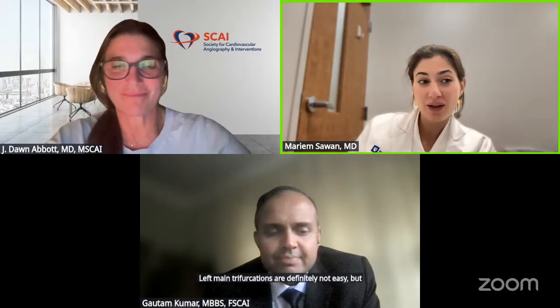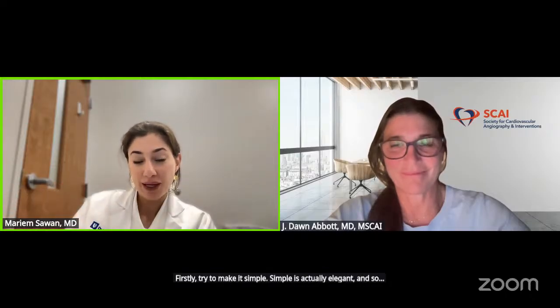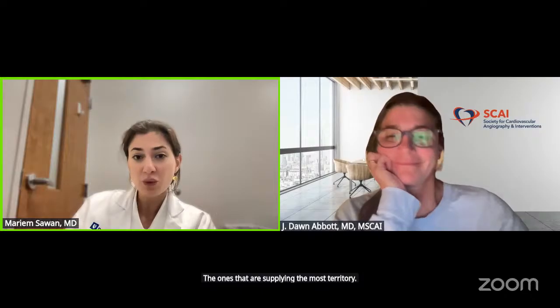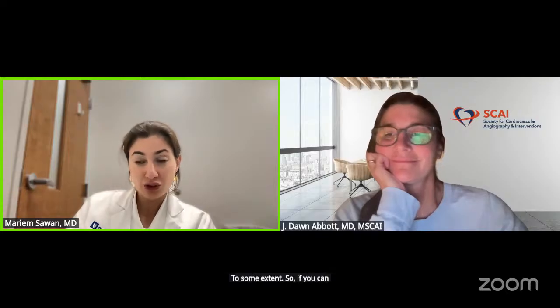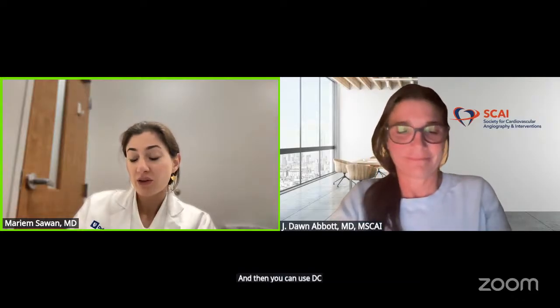But what I think the take-home messages are, firstly, try to make it simple. Simple is actually elegant, and go in with a plan in mind. Which vessels are the ones that you cannot lose? Usually that is the ones that are supplying the most territory, and which one you're not going to be upset if you lose to some extent. So if you can get away with only a 2 stent strategy, that's better, and then you can use DCB for the remaining.